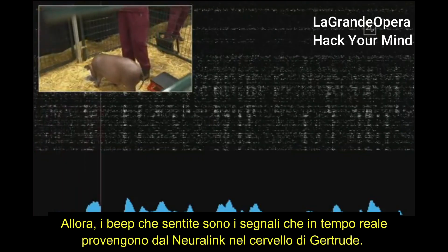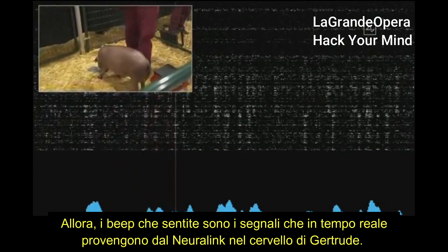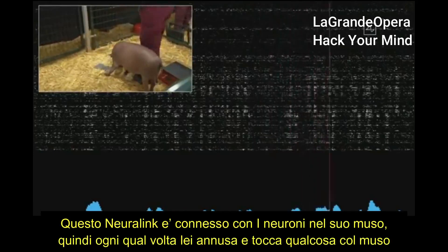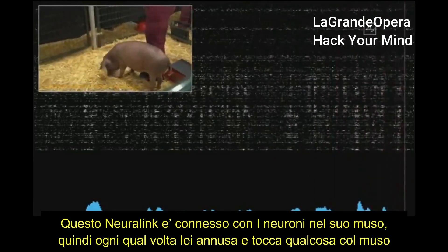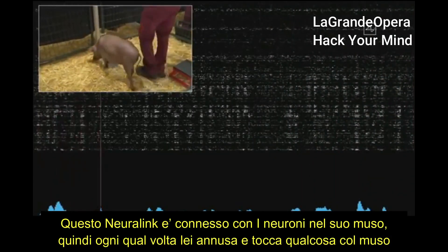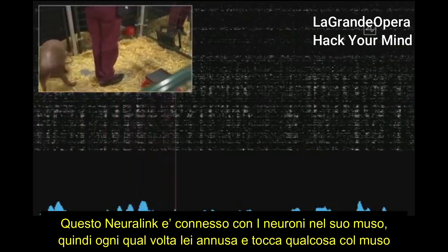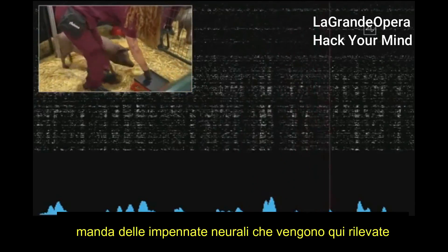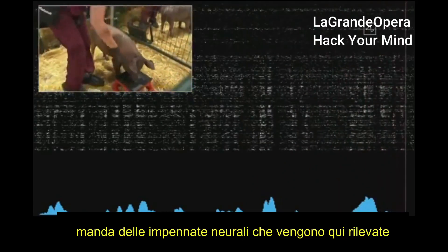The beeps you're hearing are real-time signals from the Neuralink in Gertrude's head. This Neuralink connects to neurons that are in her snout. Whenever she snuffles around and touches something with her snout, that sends out neural spikes, which are detected here.